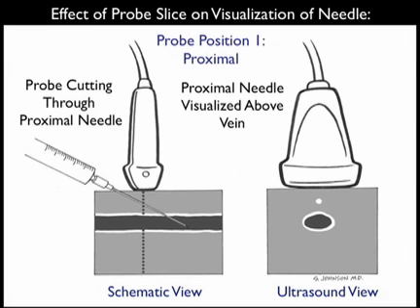When using the short axis orientation, it's important to remember the effect of probe slice on visualization of the needle tip. Here we see the probe positioned proximally along the needle shaft. Note in the schematic view towards the left, we see the needle with the tip squarely inside the venous lumen. However, the ultrasound probe is positioned more proximally along the shaft, and thus on the ultrasound view to the right, all we visualize is the needle above the vessel, even though the needle tip is squarely within the vessel lumen. So we get a false determination of the tip of the needle.